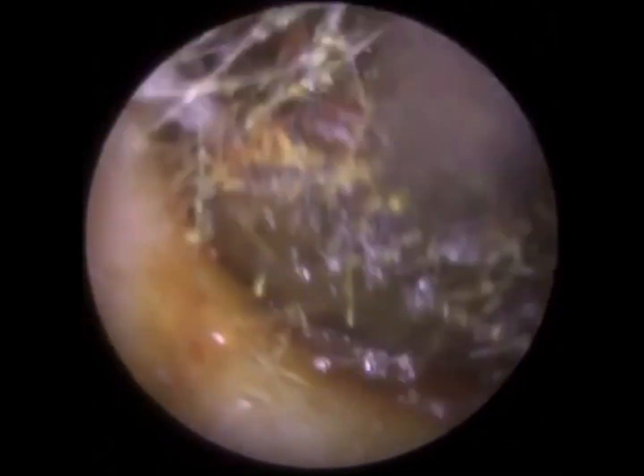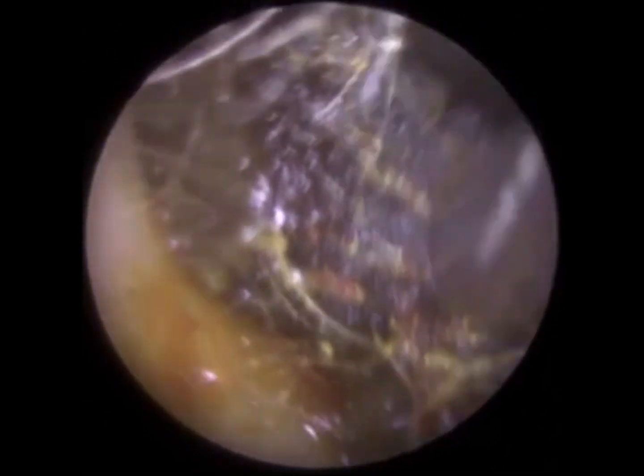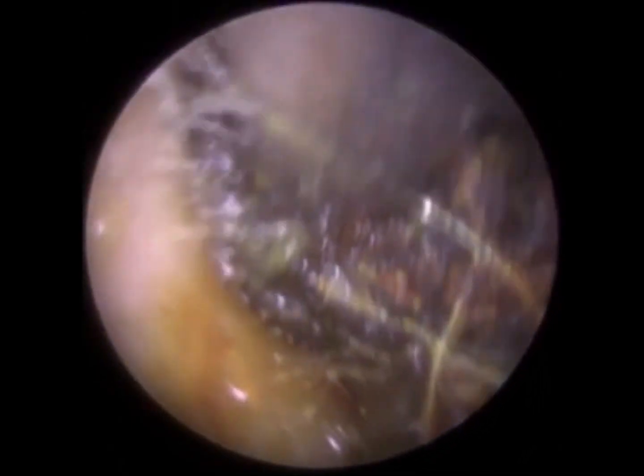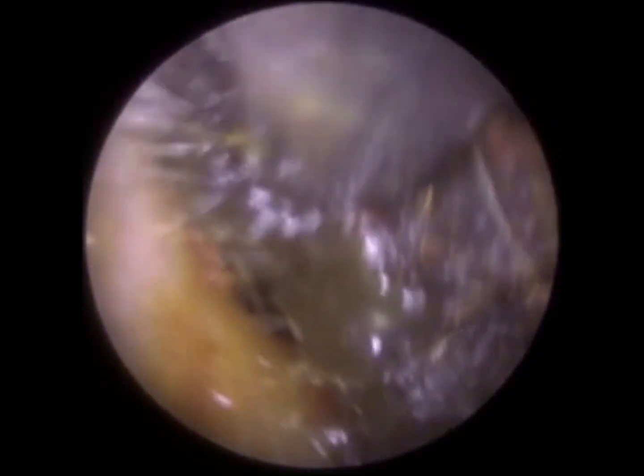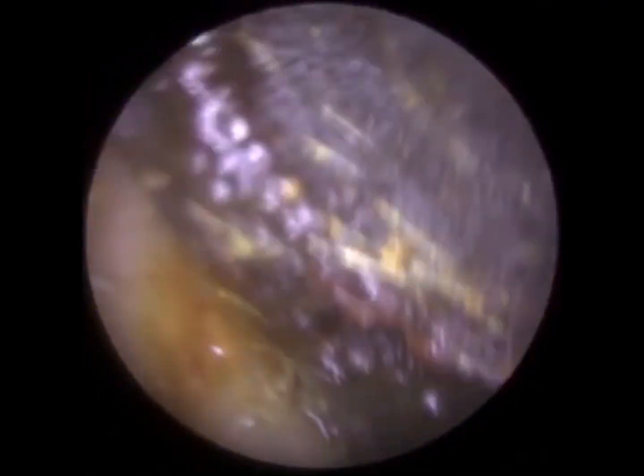Most people's ears have a narrower entrance than the rest of the ear canal in some segments — the ear canal generally widens inward — so this plug, which was very deep where the canal is a bit wider, we're having to extract through a narrow entrance aperture. But we're getting there. I often joke with patients it's like giving birth — I can see the head of the baby, the head of the wax in this case — which gives them a little giggle. The patient can actually feel it at this stage; they're getting some relief, they know the wax is off the eardrum, but the hearing is still not fully 100% restored at this point, although it has improved because the wax is still blocking the entrance.